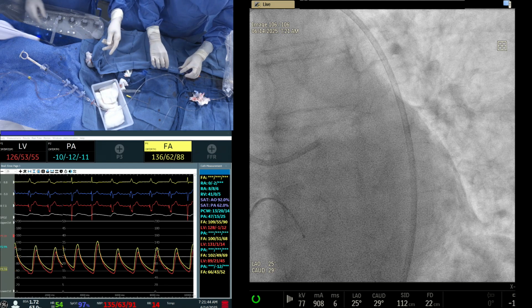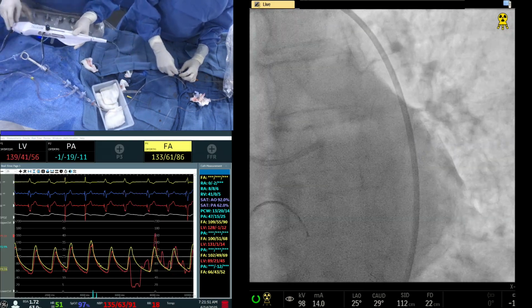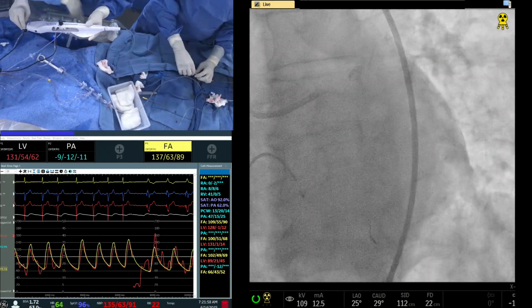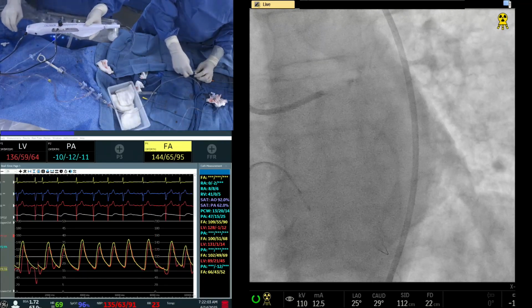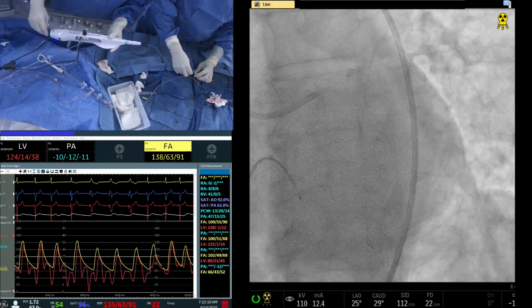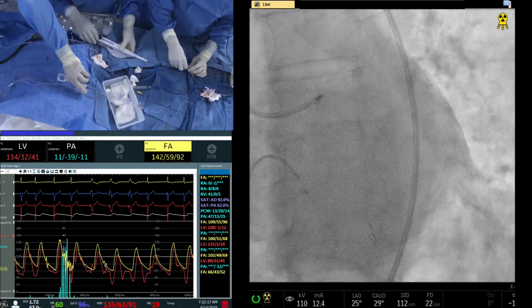What is the anticipated strategy, Dr. Sharma? So very interesting. In this case, with this age, we are just going with the Plavix. Remember, a lot of data now on patients with the old. One second. They cannot see the wire clearly. Is the light down? Okay. Good. Can we do a little light down? Yeah. Good. So in this case, long term, he could not tolerate any NOACs. So he's on Warfarin for his AFib. So this one will be a case of clopidogrel and Warfarin.